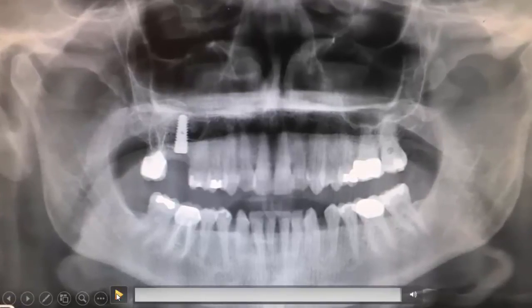هون هلا مثل ما شايفين بالإكس-راي we have a dome-shaped radio opacity around the implant which gives a good sign for the sinus elevation. هلا المشكلة هون مثل نحن ما شايفينها على الميزيال aspect it's not completely radio opaque. نحن بنحب نشوف إن البون graft reaching the anterior wall on the X-ray. فهاي الخطأ نحن بالحالة إنه ما عملنا X-ray قبل ما نحط الزرعة وما عملت packing للبون graft ضمن الأوستيوتومي قبل ما أحط الزرعة. So this is what we see now.